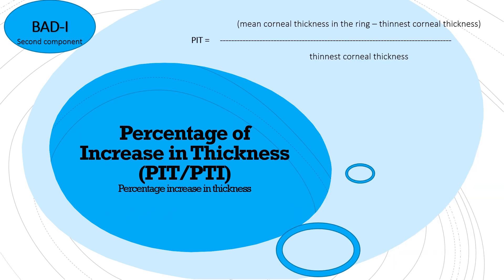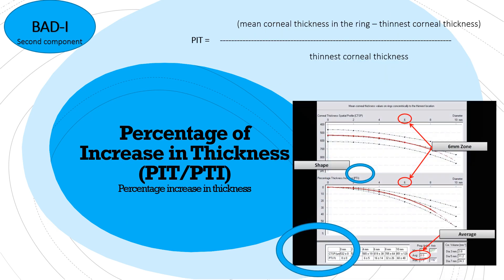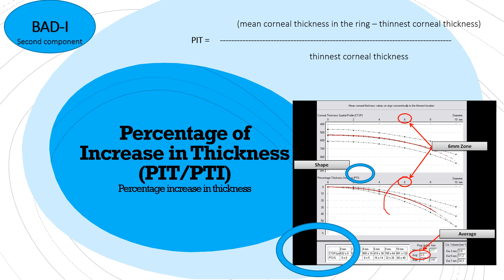Then comes the PIT — the second line. Again, the line should follow the dotted line and remain within it, and should not leave it until the 6 mm mark.